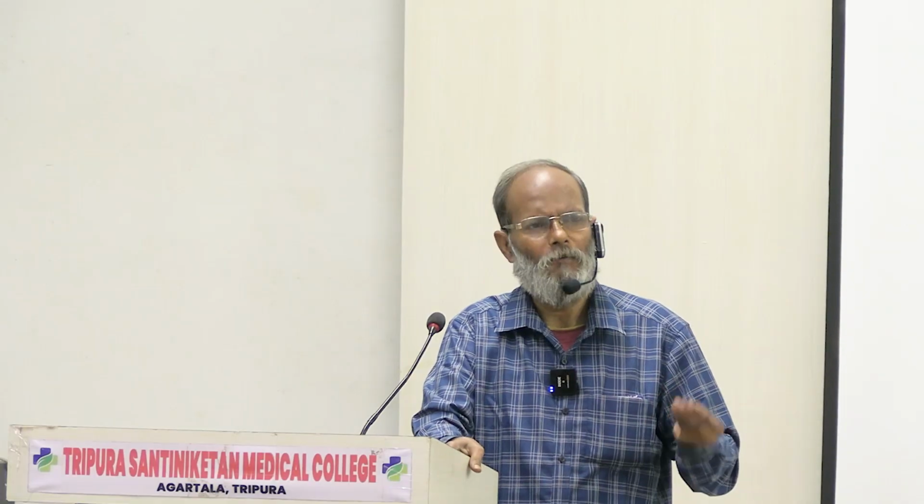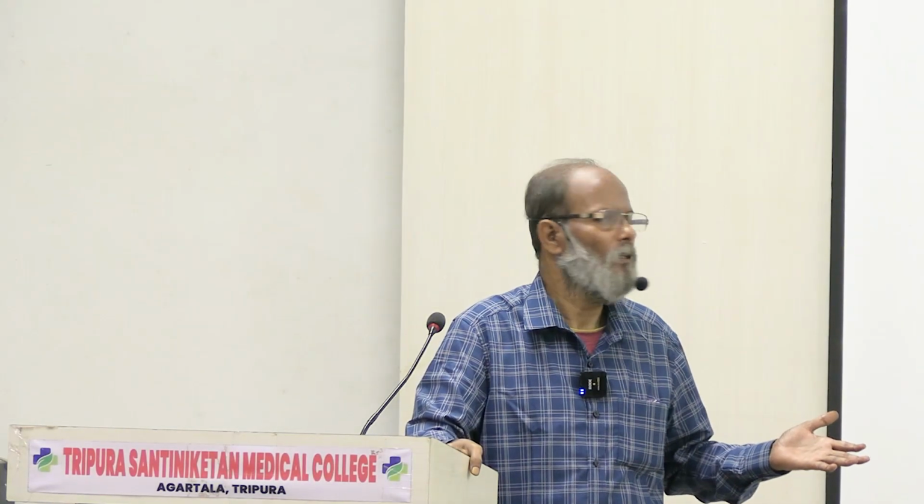If it is not there, then first we do the plain X-ray, then after 5, 10 or 30 minutes we take the contrast X-ray. Then we compare with the other side, and then we are able to tell what is happening out there.